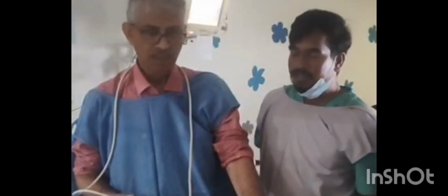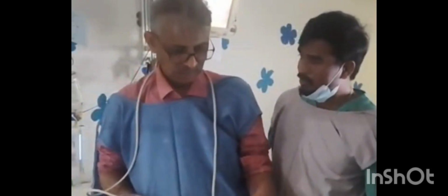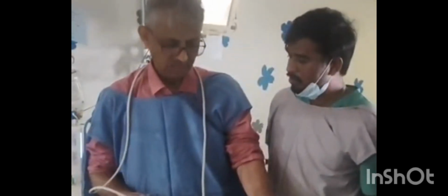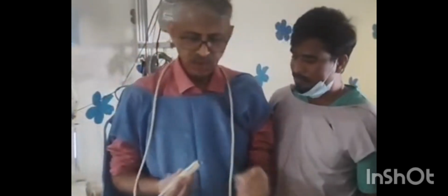Sir, we are suspecting multi-system inflammatory syndrome in newborn in this baby. Sir, we want to see the coronaries in this child. So how to demonstrate the coronaries? Yeah, good.